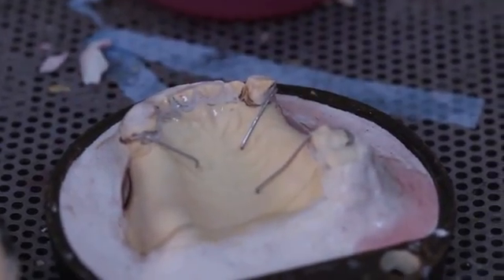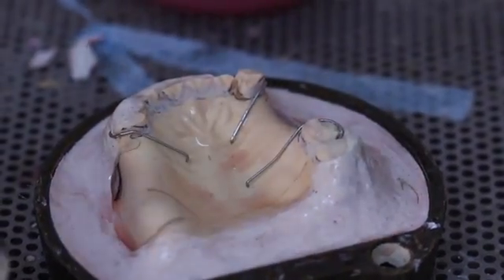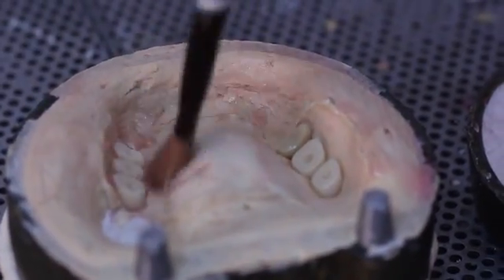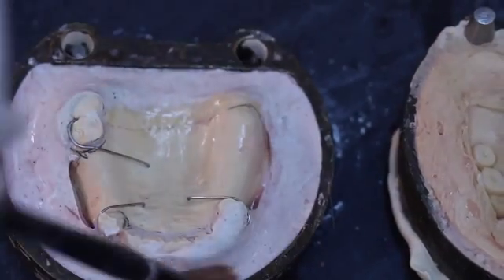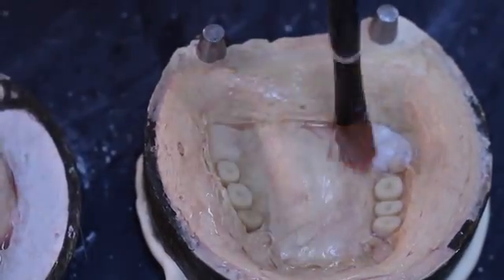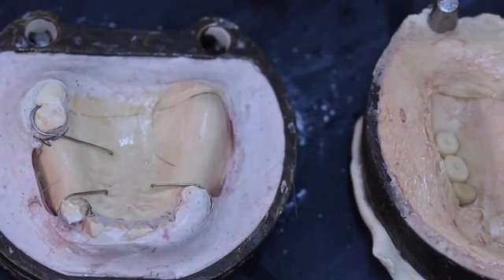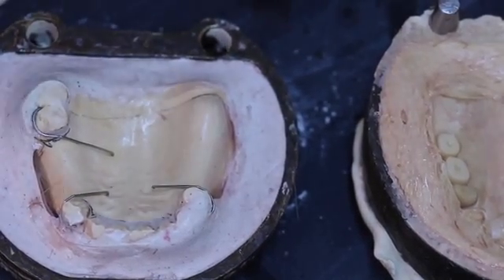While the flask is still warm, one coat of sodium alginate separating medium is applied. Make sure that the separating medium is not applied to the ridge lap areas of the artificial teeth. Apply a second coat of cold mold seal or sodium alginate on the fitting surface of the cast. Apply resin monomer on the clasps and the ridge lap areas of the artificial teeth to facilitate chemical bonding.